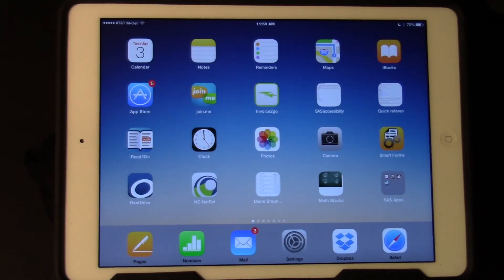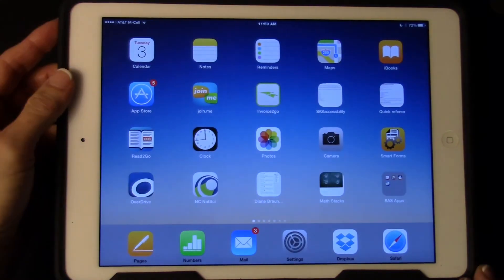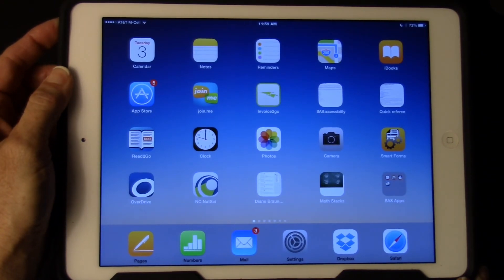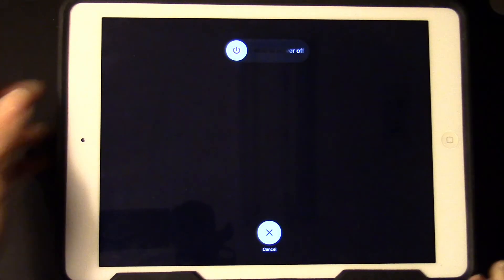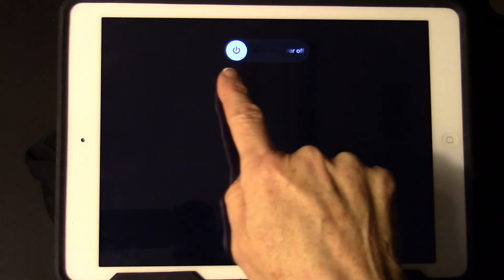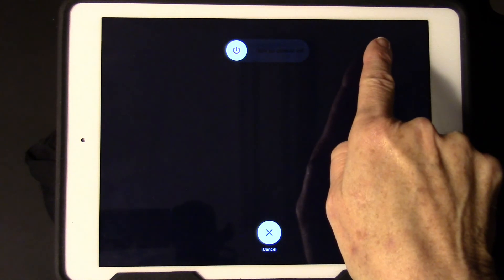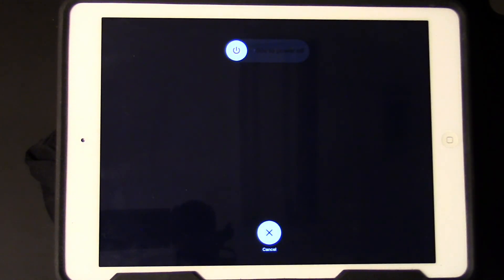If I need to reboot the iPad — for example, if I was not fast enough to put in my code 1-2-3-4 — I'm going to hold the power button until I get the display with a slider arrow. I'll slide it across to power off and let the iPad reboot.